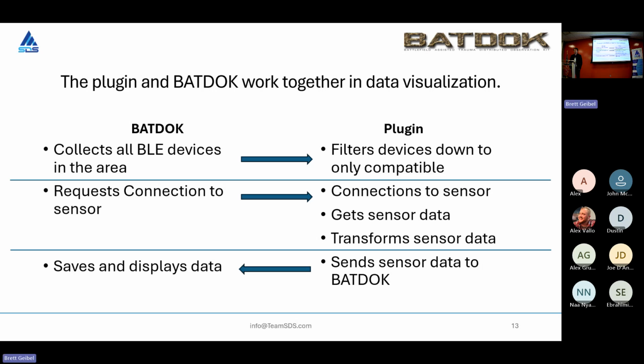Yeah, I think that's correct, and it can use multiple different sensors at a time, and you can assign multiple sensors to a single patient, or you can even have one sensor to one patient. And like what this gentleman just said, on your BATDOK application you can have a list of 6 or 8 patients that you're monitoring at the same time. And that medical professional can then change their focus based on the dire needs of certain individuals.